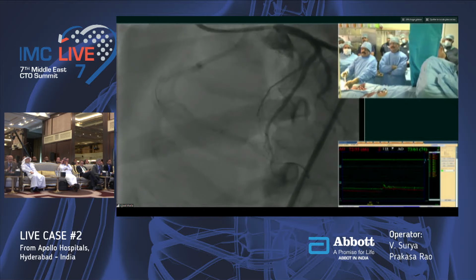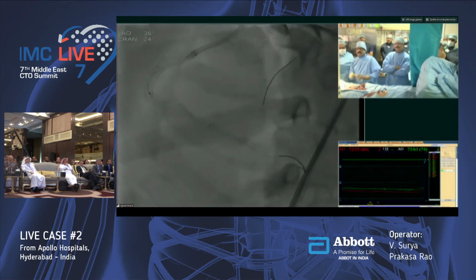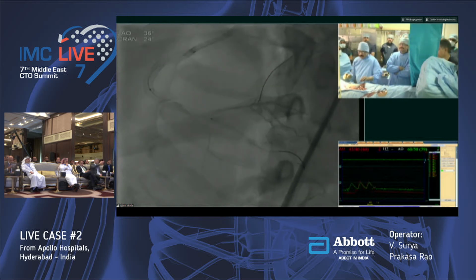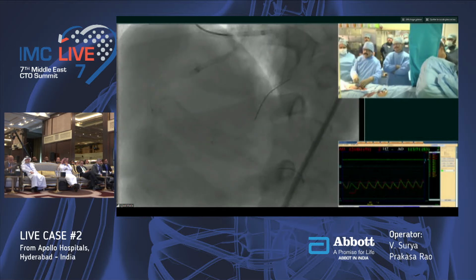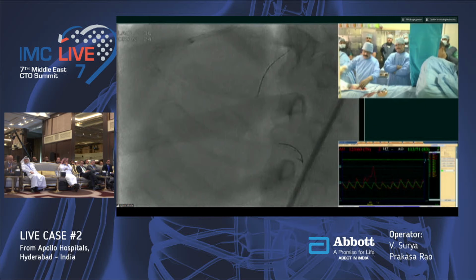Retrograde, once retrograde injection. You can see the PLV is filling. You see, it's not a small branch. We can do an opening of the PLV, not an issue with the stents. So now we are doing the 3.5 balloon for the proximal part of the stent, which is the 3.5 stent. For the ISR we are doing a DCB of 3.5 by 40.